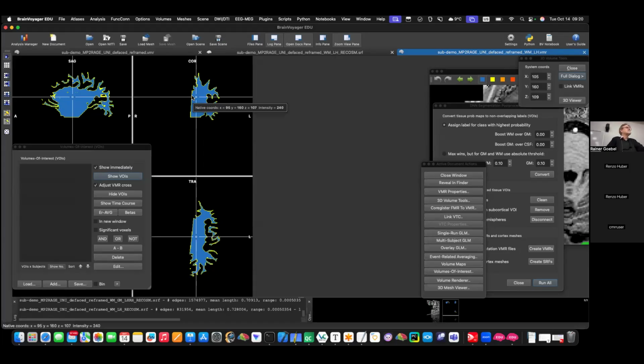But then you would have to combine the topologically corrected white matter with the gray matter, in order to then get an exclusive connection with the gray matter, right? You have to somewhat write some code, because now the voxels are corrected, you either have to remove or add from gray matter accordingly. What you can also do is you correct those and run it through the advanced segmentation, which I mentioned yesterday. You can still do that. It does these things then for you. But you start with the DNN segmented white matter and then let it do its other job.